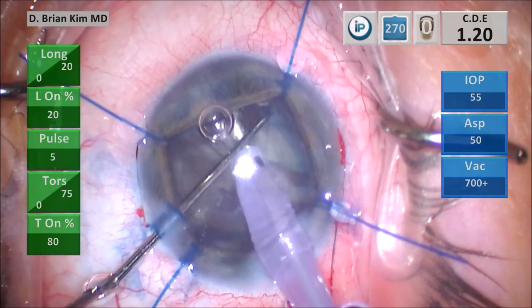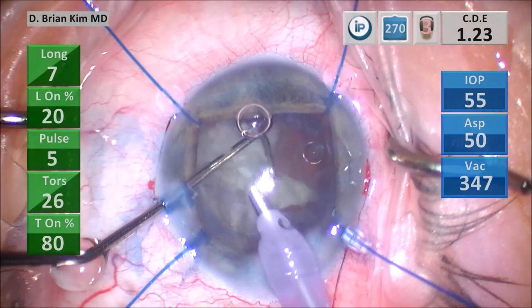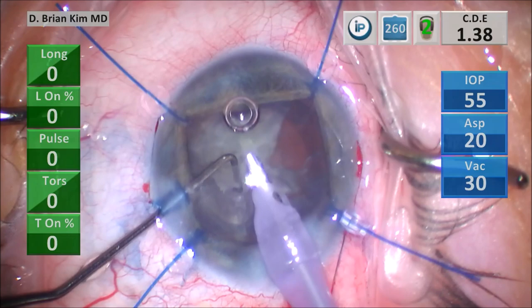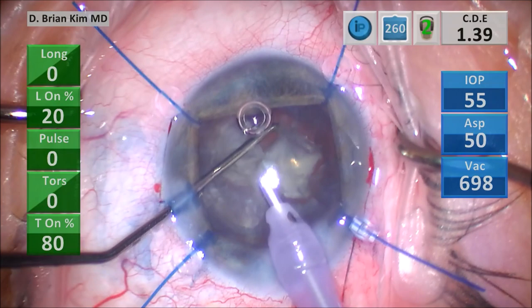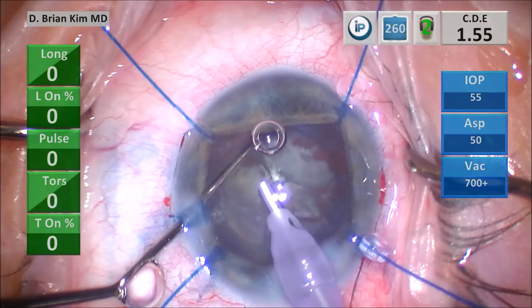I place the chopper out to the equator again, crushing the third quadrant in half and emulsifying, using high vacuum and bursts of ultrasonic energy. Going after that third quadrant gently, using vacuum to position the lens on the tip and then crushing it with the chopper. Going after the fourth quadrant, placing the chopper around the lens material and crushing it against the phaco tip.